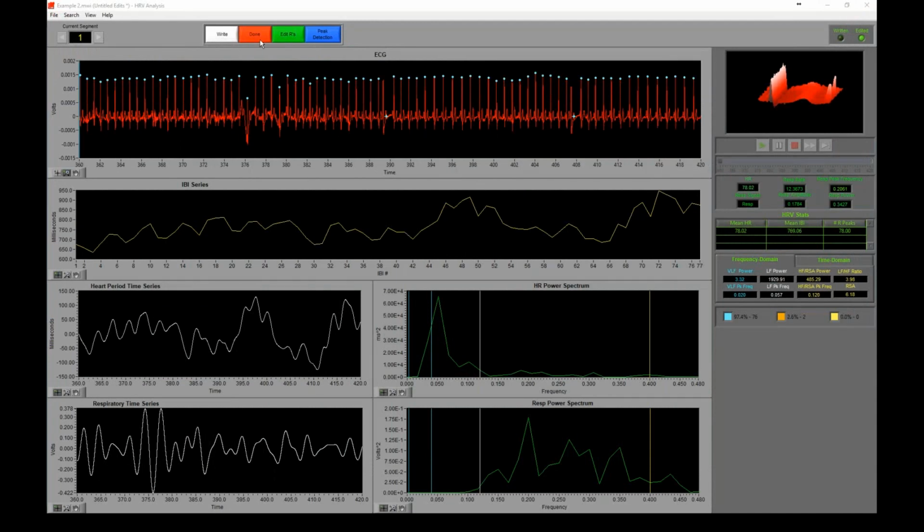Now, depending on the severity of the arrhythmia that you're experiencing, this is one way in which you can pretty quickly start to exceed that 10% threshold. So just make sure that you're always watching that to make sure that you aren't.